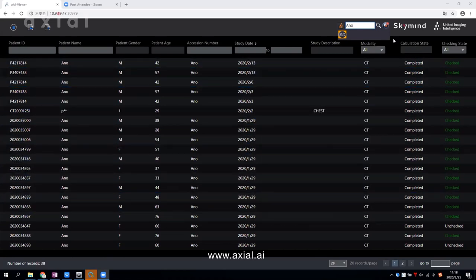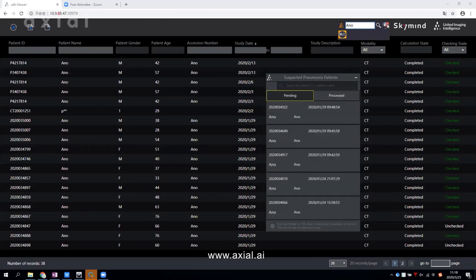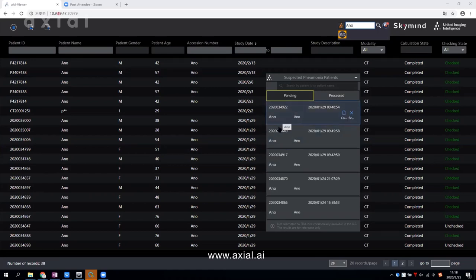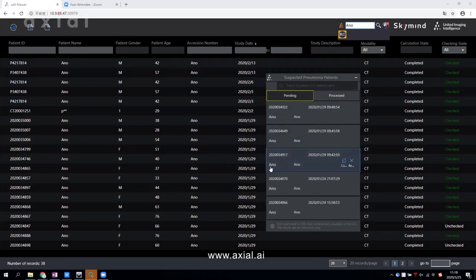Here is the small icon which looks like pneumonia. Click that and you will see the filtered patient list. Axial AI will put all coronavirus suspects in this list.